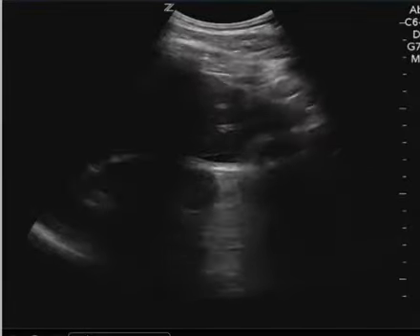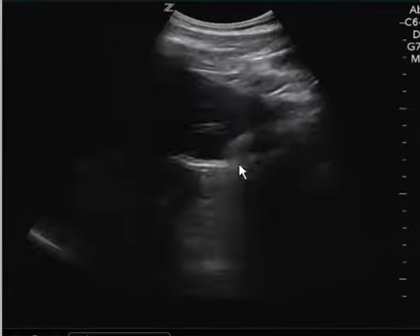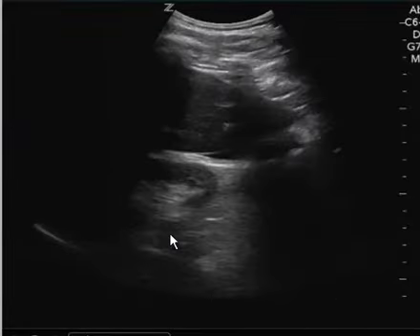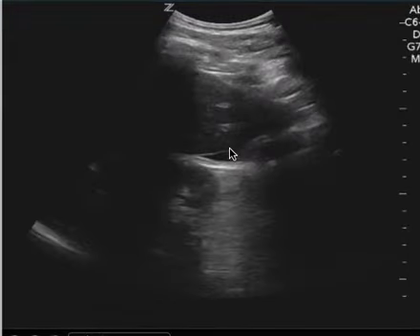This is an ultrasound that was used to look at the gallbladder, but I wanted to make this video to illustrate how there's positive free fluid. You can see there's this little pocket of anechoic finding here, right through the rib space. When you freeze it and look here, you see this triangle shape of anechoic free fluid.